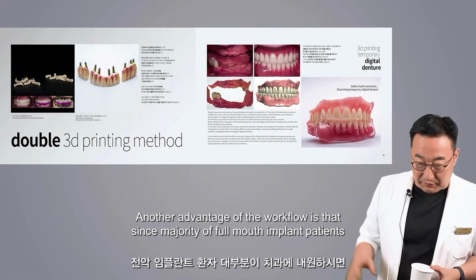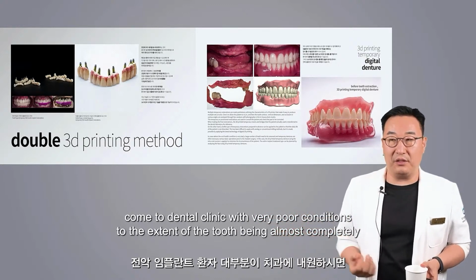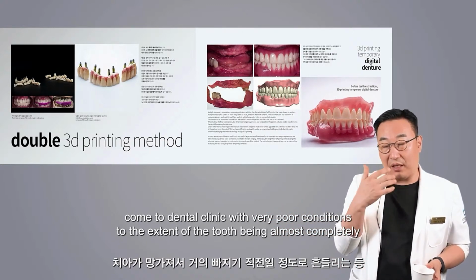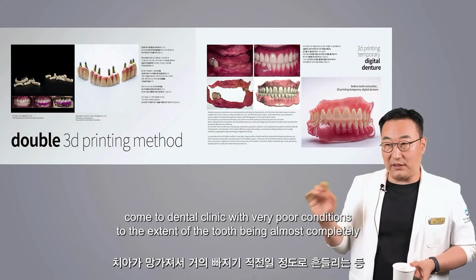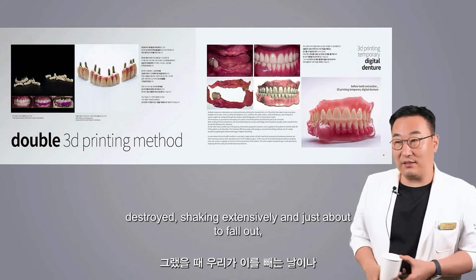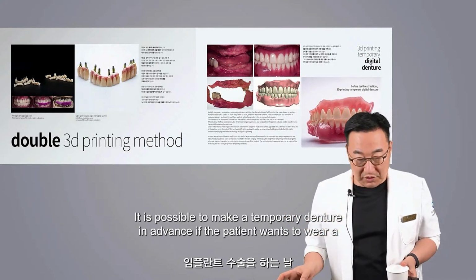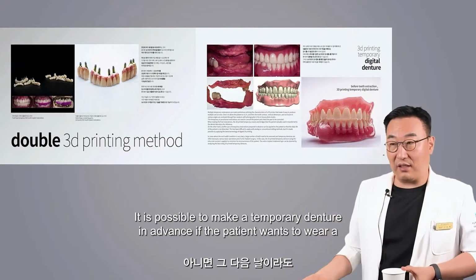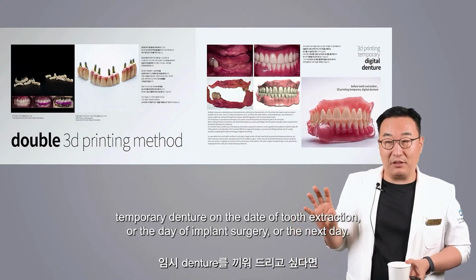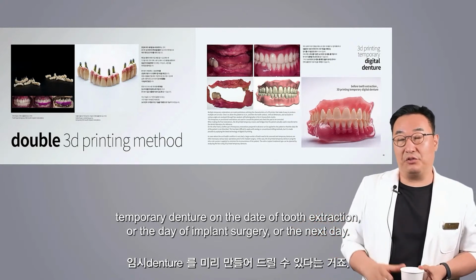Another advantage of the workflow is that since the majority of full-mouth implant patients come to the dental clinic in very poor condition, to the extent of the teeth being almost completely destroyed, shaking extensively, and just about to fall out, it is possible to make a temporary denture in advance if the patient wants to wear one on the date of tooth extraction, the day of implant surgery, or the next day.